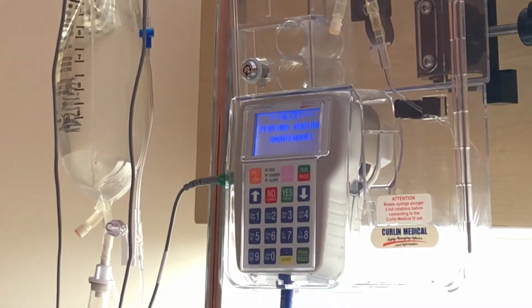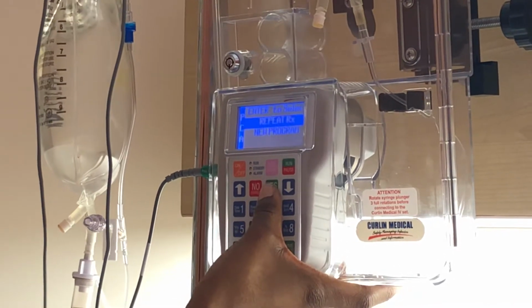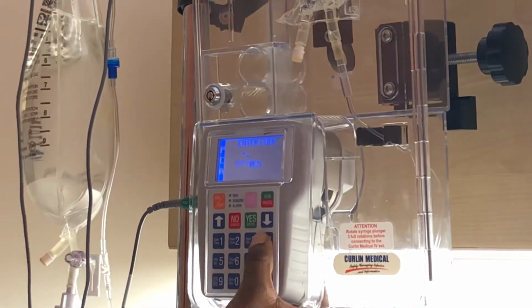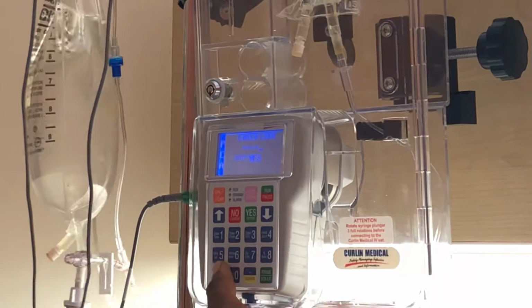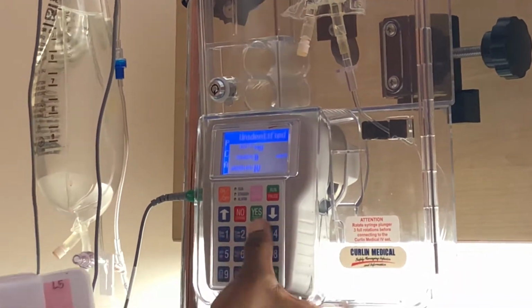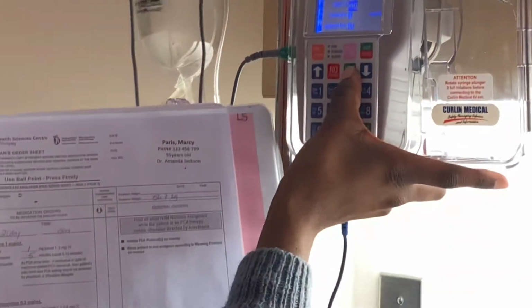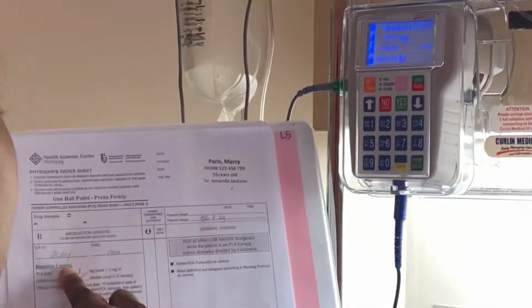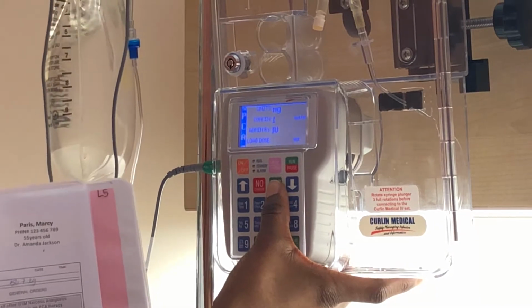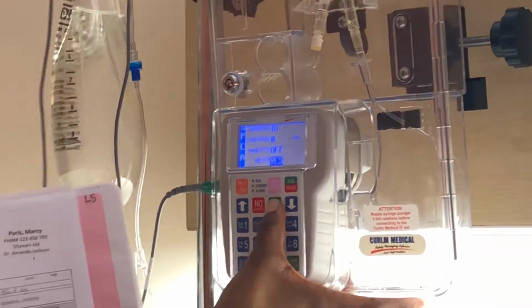So I'm just going to let that run. Program, yes. So the code, I'm just going to put the code. Okay, so now, yes, units is in milligram, we have milligrams, so yes. Concentration, milligram per mil, we have one, yes, and this is going IV. And low dose, there is no low dose here, so yes. And main limit off. And next, yes.